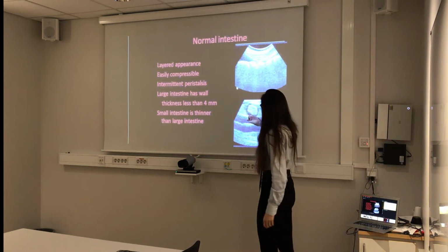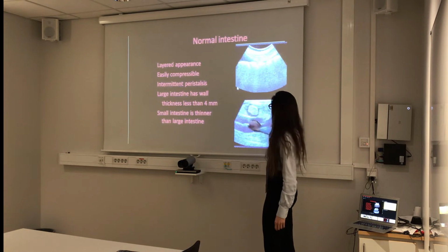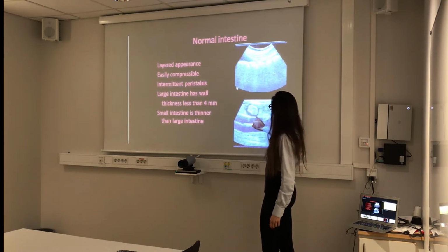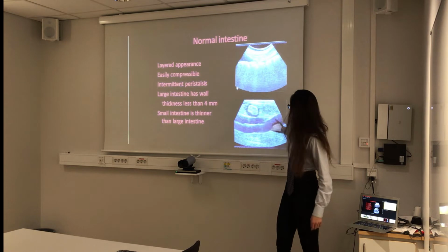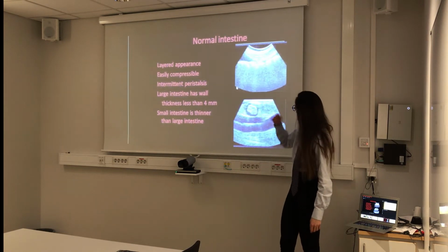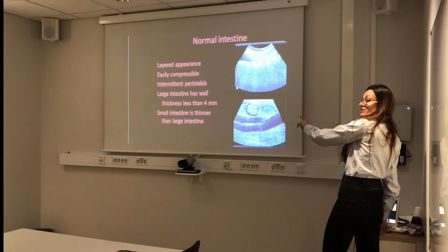Look at this stuff. So these are vessels, probably iliac vessels. I wonder if this is appendicitis or is just small bowel. So I can't say anything here, I cannot evaluate this structure. For sure, if this structure is sitting here, this is stomach. It's not sitting there because this is a vessel, so it looks like an iliac vessel. So it looks like an appendix, but I don't know, maybe it's just small bowel. Okay, not a pathological finding though.